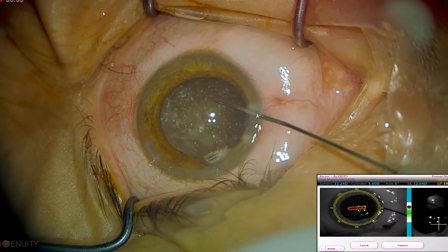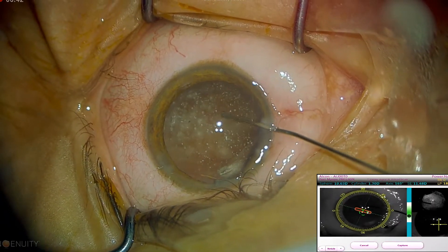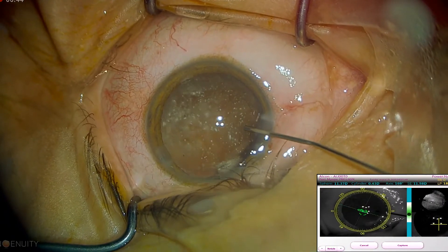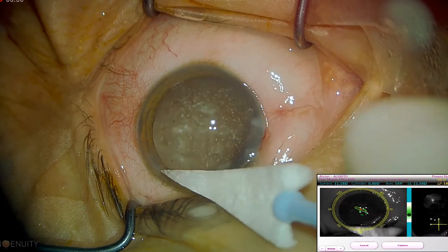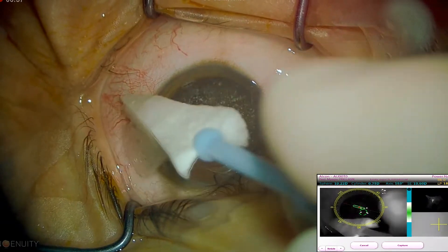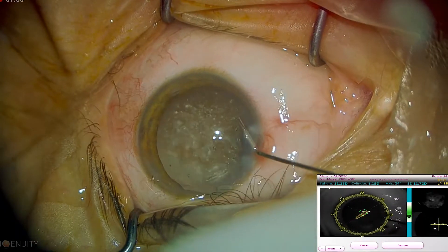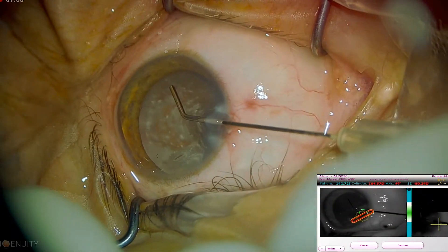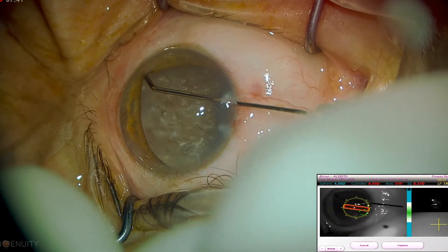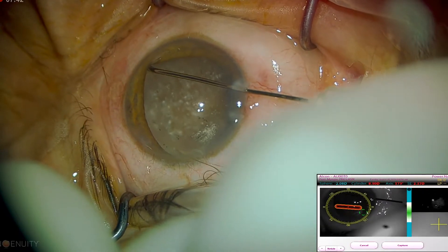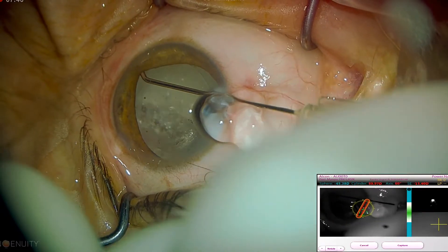We attempted intraoperative aberrometry, but as one might suspect, it was not possible due to the dense vitreous opacities. A triamcinolone-moxifloxacin compounded injection was given transzonularly, and you can see the interface between the medication injected into the vitreous and the dense asteroid hyalosis.